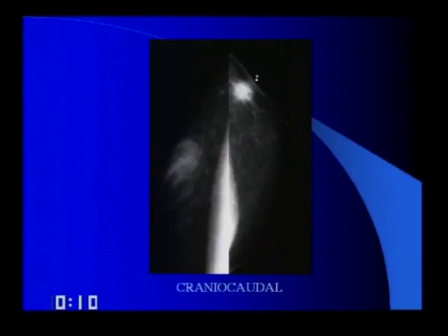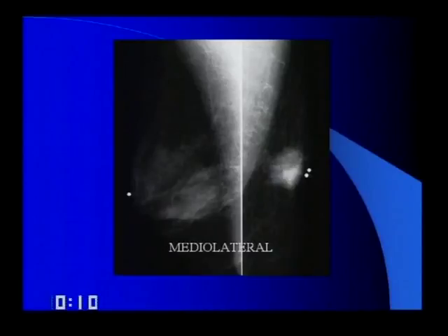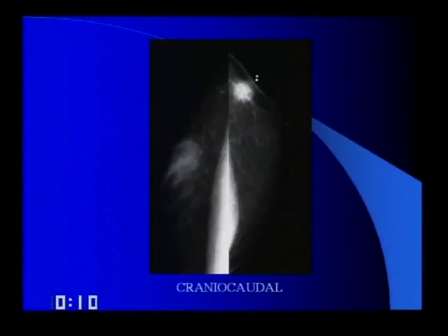Cranial caudal and, oops, went the wrong way. Cranial caudal and MLO views. Okay, so there is, in the left outer breast, first of all, these are either very small breasts or this is a man. Okay, who's going to vote small breasts? I think this is a man. Okay, and that this is a male.